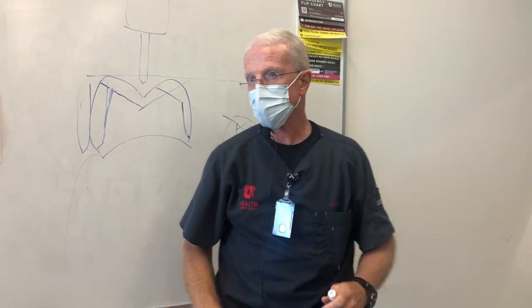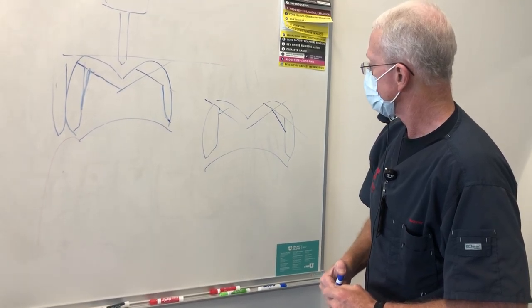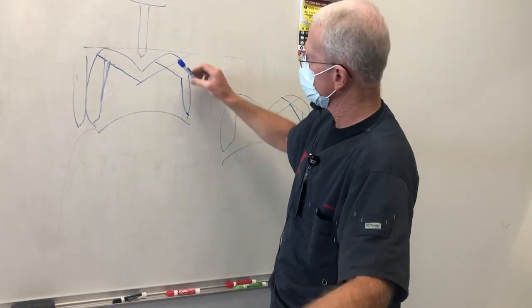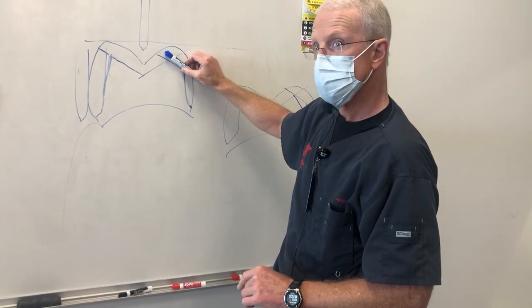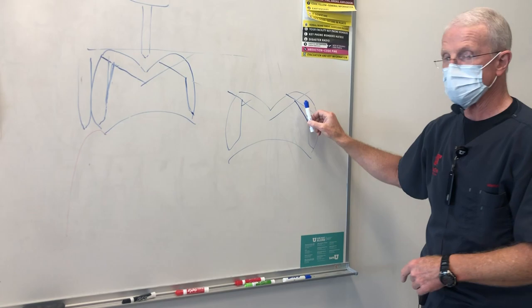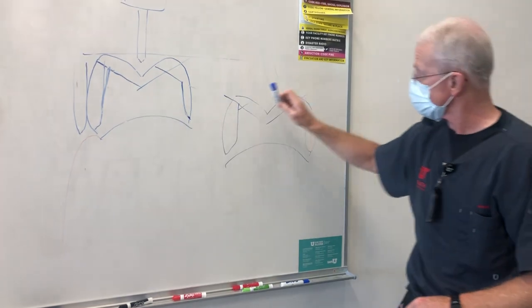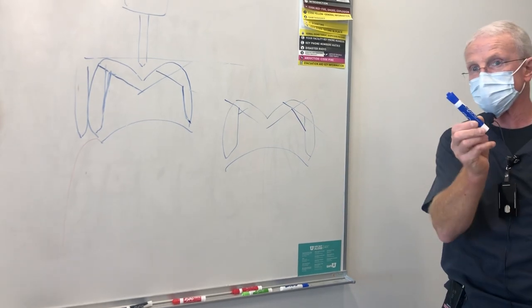Because the functional cusp is on the lingual, you don't have as big of a bevel, which is why it's a little bit thinner, and you have to have the two-plane on the buccal side. So repeat that one time. I want to make sure I understand it. Because the functional cusp is on the lingual on top. Right, and the functional cusp is on the buccal on the mandible. That's why we don't have to do the two-plane, because the functional cusp takes out the two-plane. Exactly. The functional cusp bevel on a lower posterior tooth takes into account the contours of the tooth and does the same thing as your two-plane facial reduction, and it gets steeper toward the anterior.